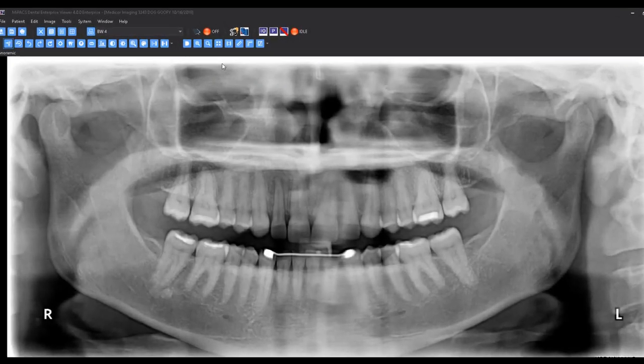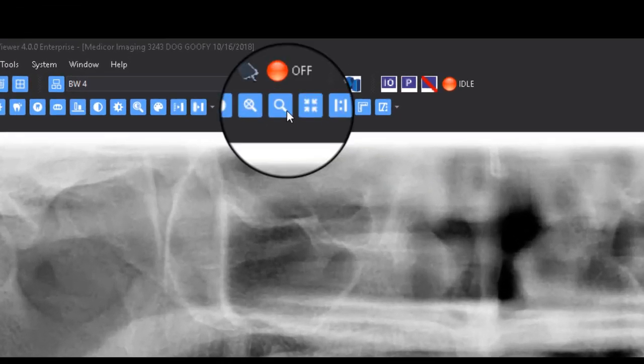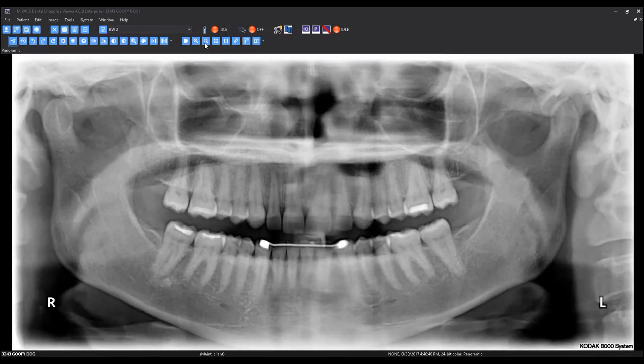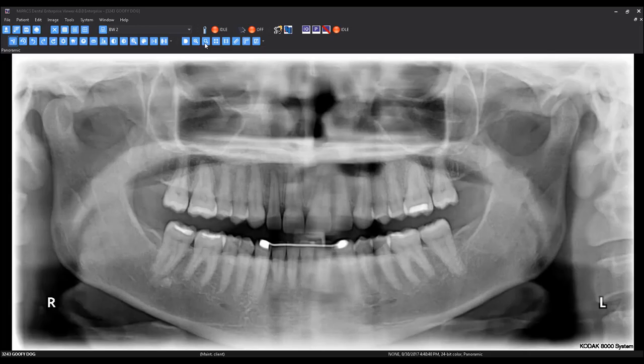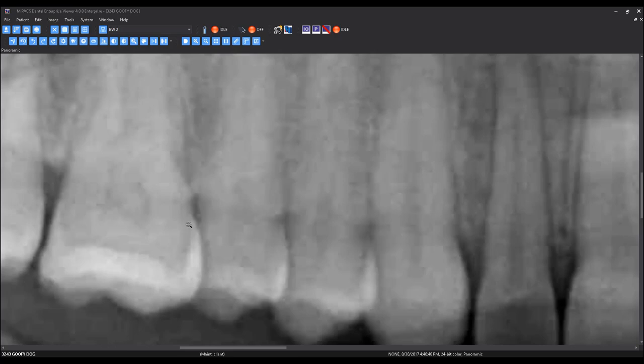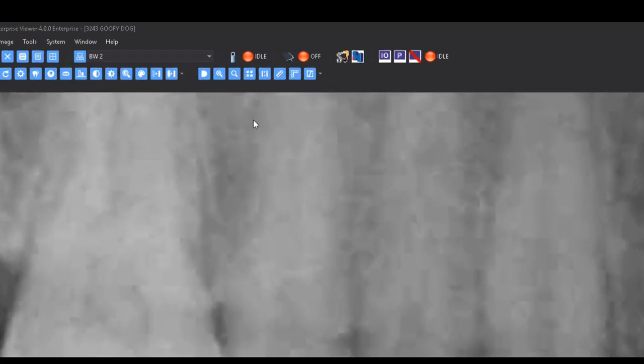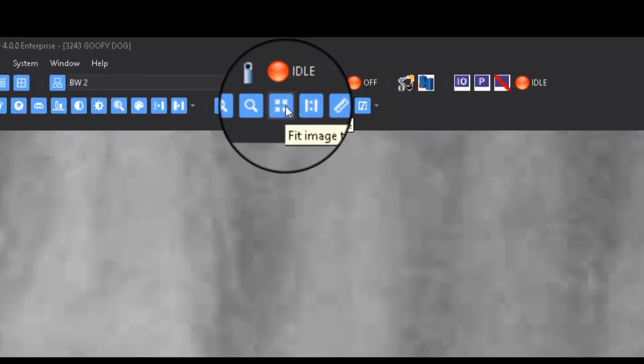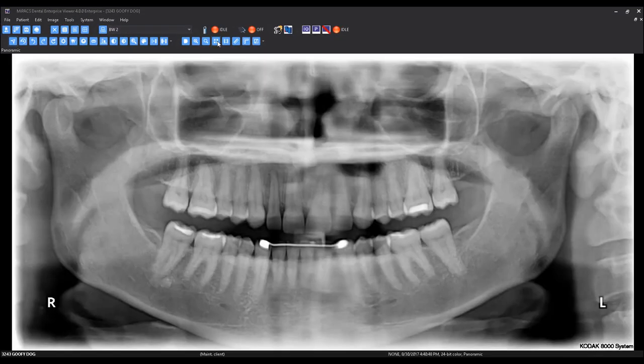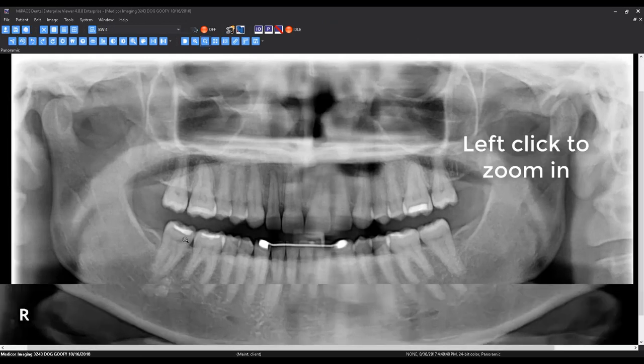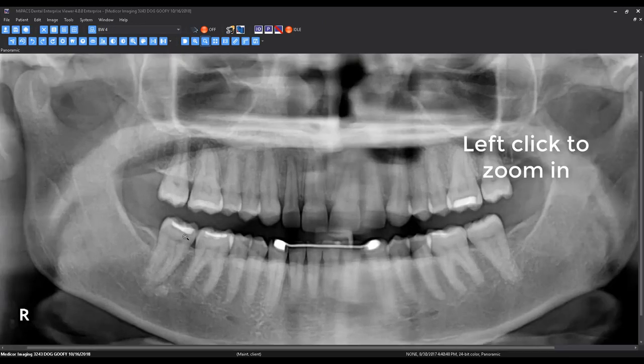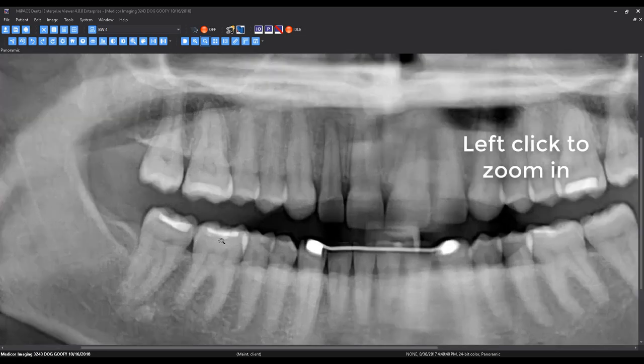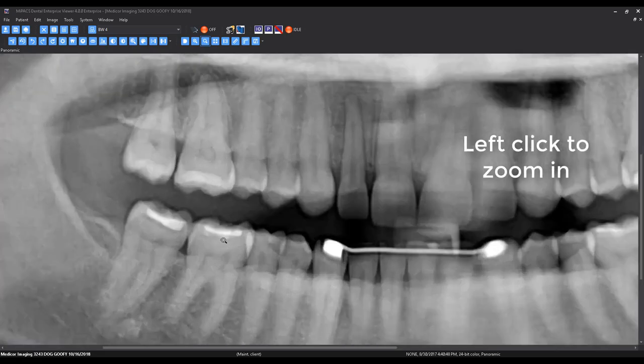With the zoom button depressed, there are two ways to zoom into an image. You can left-click and drag out a selection on an image to zoom into an area of interest. You can also left-click anywhere on the image to zoom into the currently targeted area.